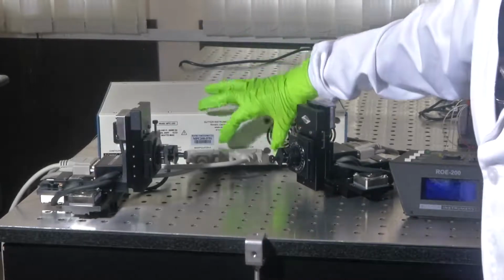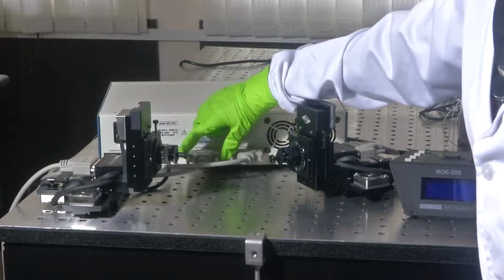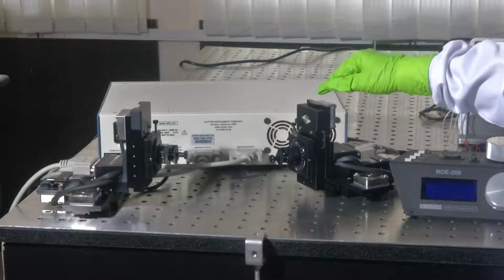So, these are the DB25 connectors which are connected for communication between the main unit and each of the manipulator arms.